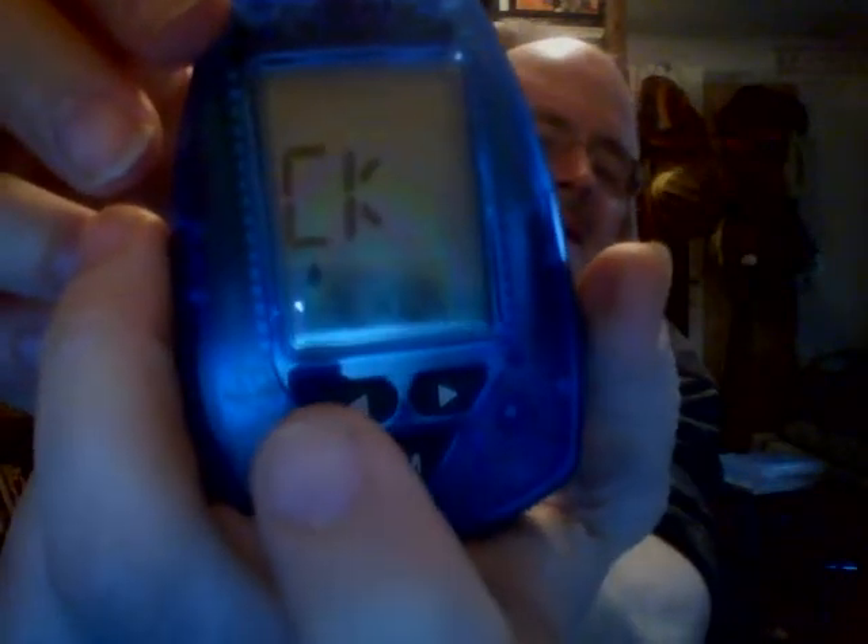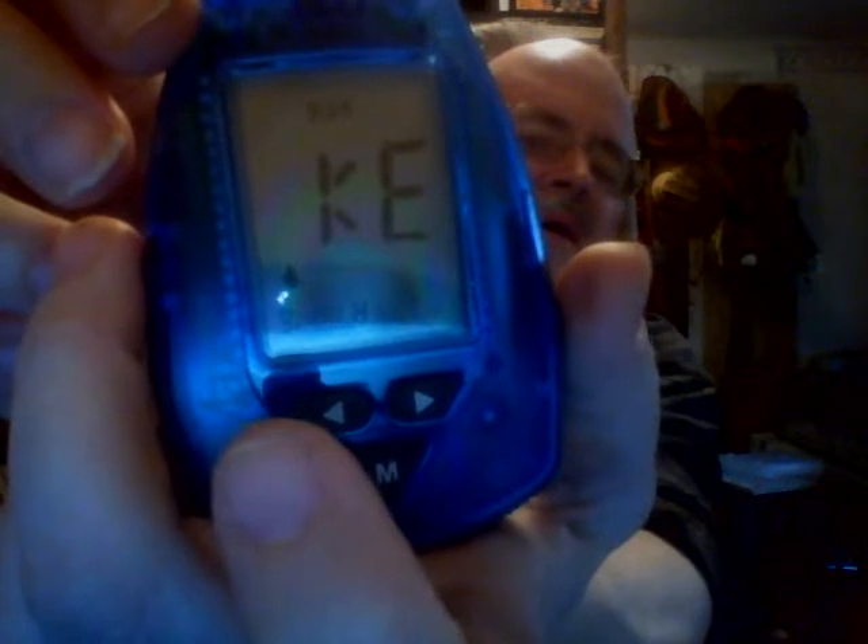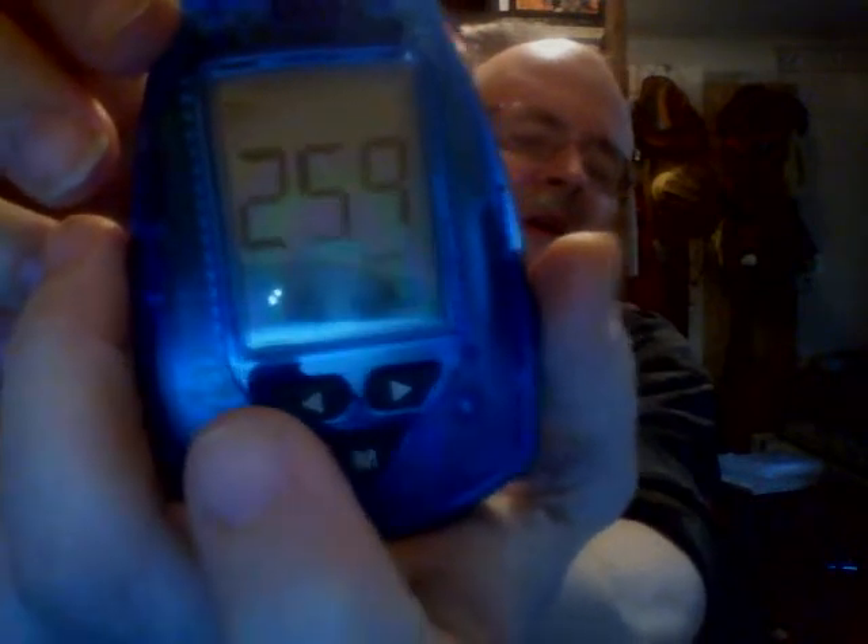And there is a nice bead of blood right there — just enough to touch this. It gets sucked up inside the thing. My reading is 259. That's not a very good reading; that's really high.